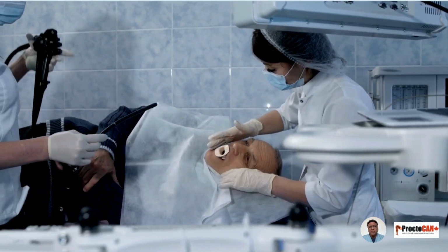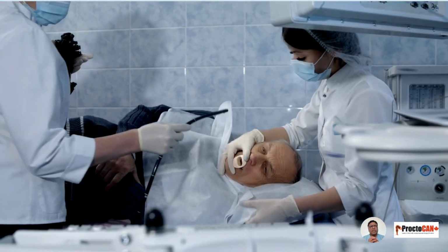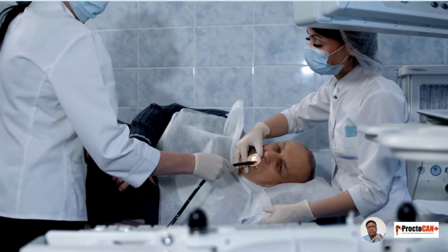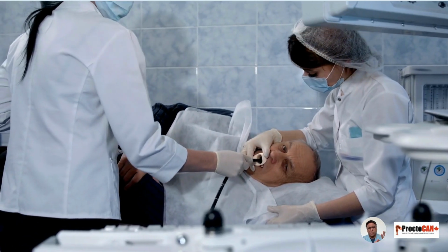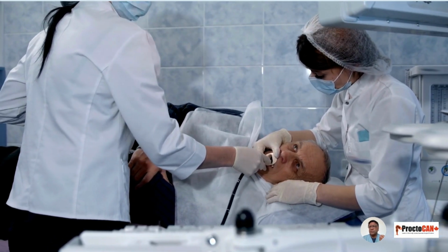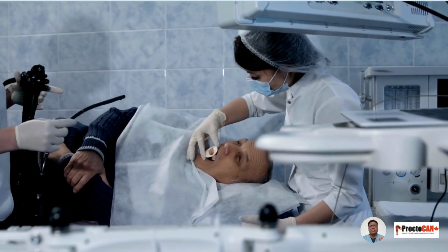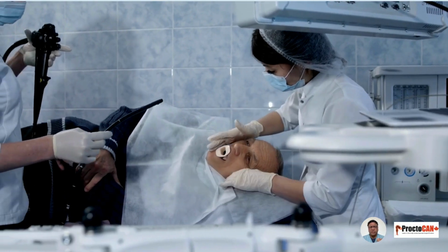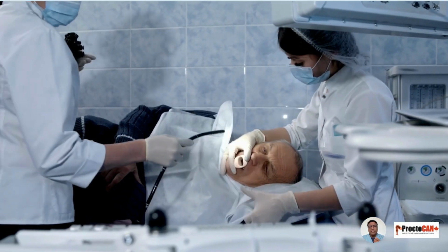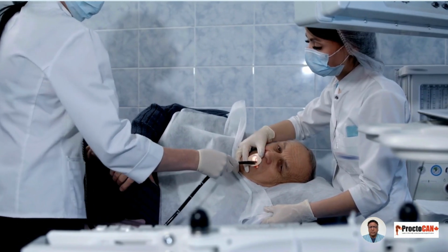You'll be lying on your left side, which provides the best view for us to examine your esophagus, stomach, and small intestine. A sedative will be given to help you relax and become drowsy and comfortable for about 10 minutes while we perform the procedure. Once you're sedated, I will gently pass the endoscope through your mouth, down your throat, and into your stomach. The endoscope allows us to closely examine the lining of these areas for any signs of abnormalities. The procedure itself usually takes about 5 to 10 minutes. If we find any abnormal areas, we may take small biopsies for further testing.